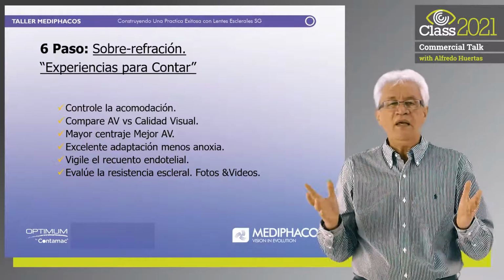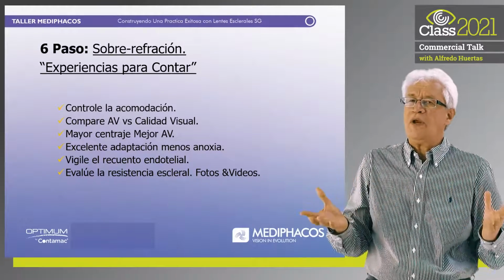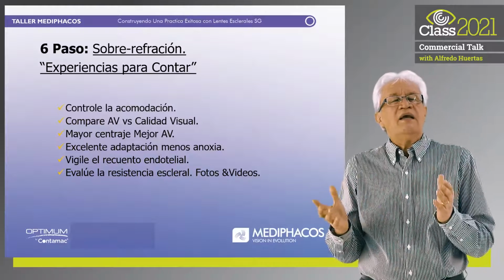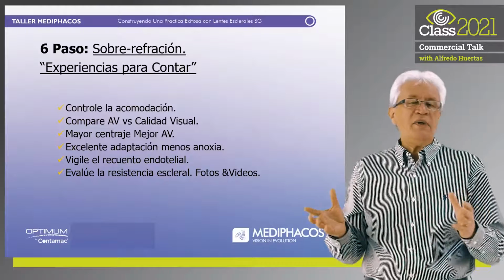There is a point that I want to address here, and it is the number of hours for the contact lens test for the patient to have. Usually, the laboratory suggests 2 hours, and really what we are measuring is the scleral resistance. But how do we do it?